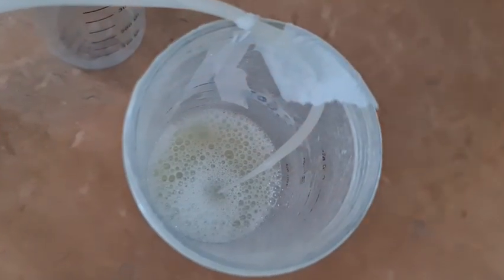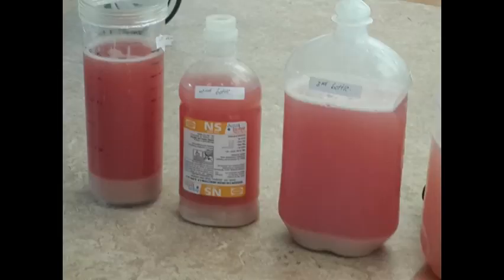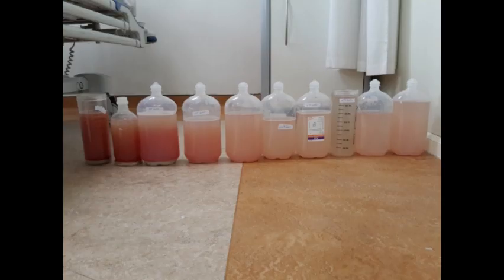One lung is lavaged with more than 10 liters of saline. The lavage fluid is initially more turbid with proteinaceous sediments. The lavage is continued until the drained fluid becomes the least turbid, without sediments.